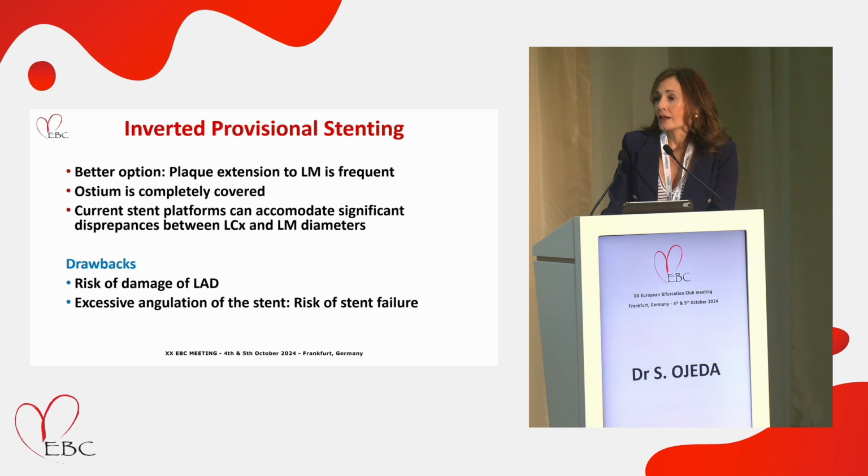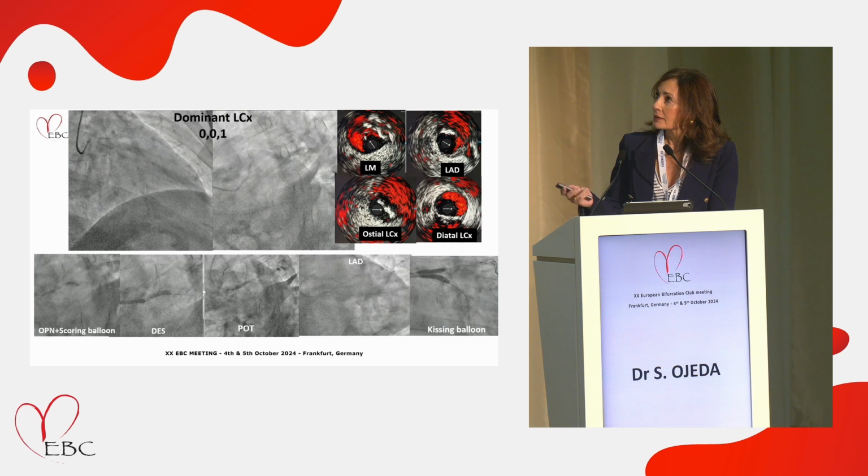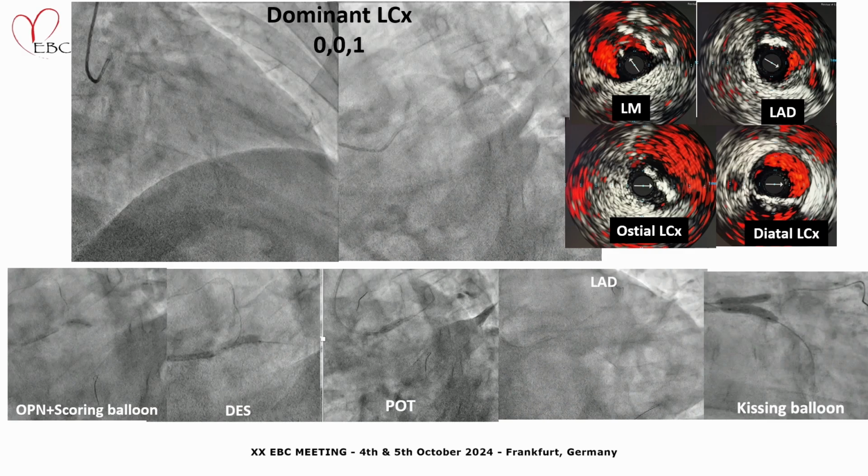Obviously, the technique also has some drawbacks. There is a risk of damage to the LAD, and if the angle is very wide, the excessive angulation of the stent can be associated with a risk of stent failure at follow-up. This is a demonstrative example video.